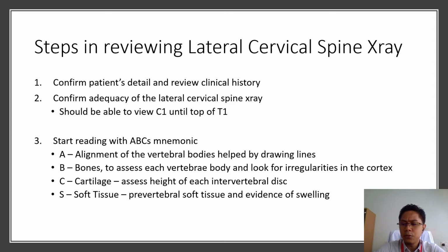So how do we interpret or review a lateral cervical spine X-ray? It involves simple steps that can be done by our medical students and also medical officers in the hospital. First of all, always confirm the patient details and review the clinical history. Why? We don't want to jump straight to the imaging. We want to see the patient first, review the patient, and know what the history is like.